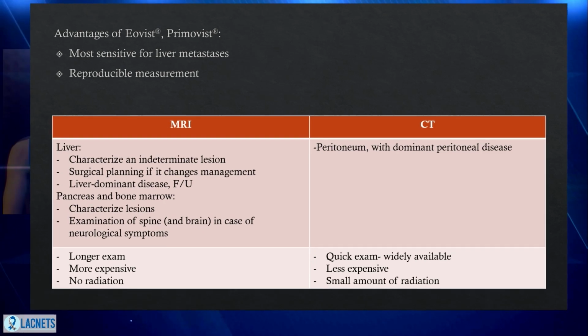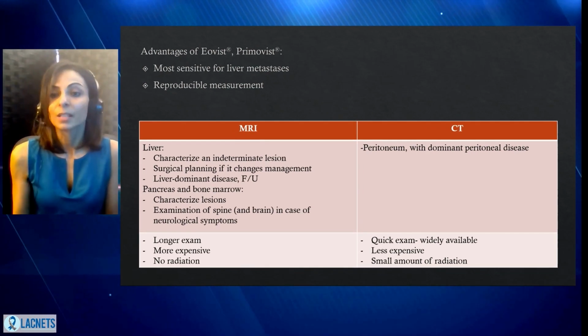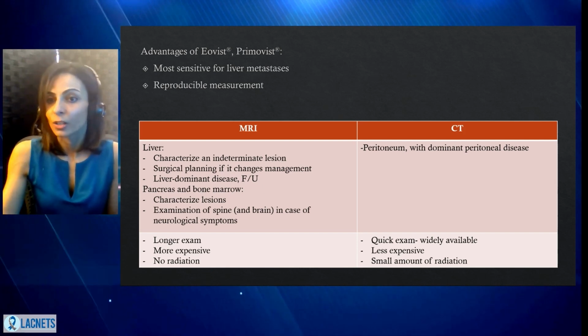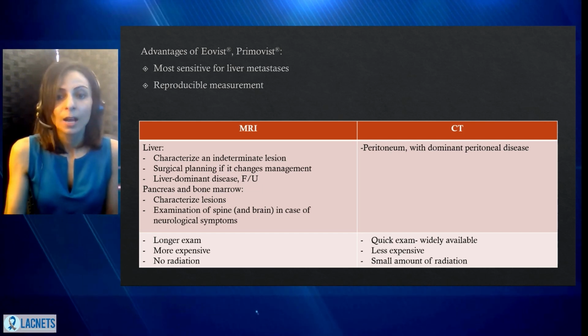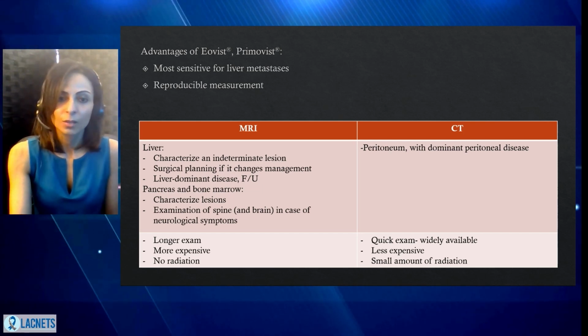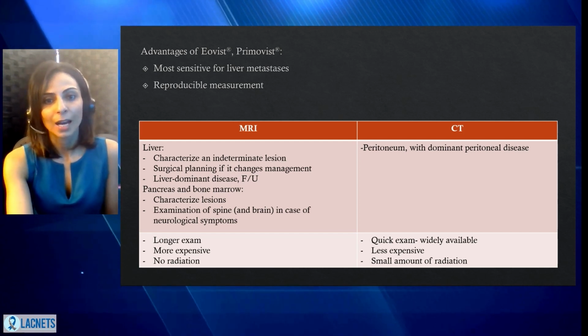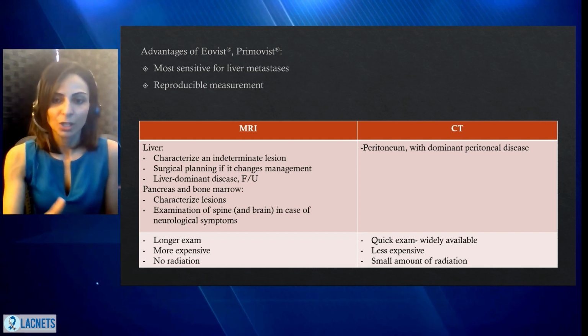MRI doesn't see the lungs well. So as you see, it's dependent really on the patient, like who needs MRI, who needs CT, depending on the indication. Other factors to take into consideration: the MRI is a longer exam. It's a little bit more expensive, might not be as available, but also does not deliver radiation. So the last point of small amount of radiation with CT, we don't worry about that if the CT is needed. And for adult patients, it's much less of a concern.